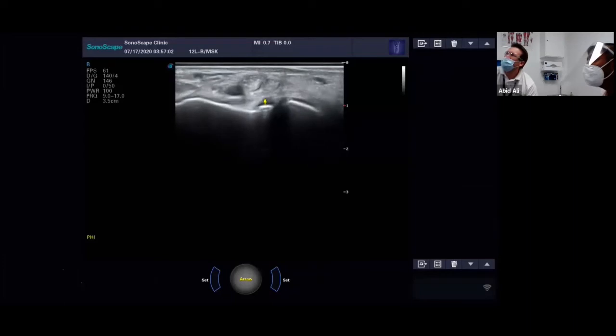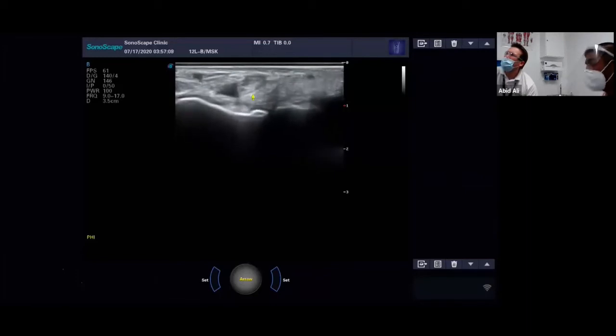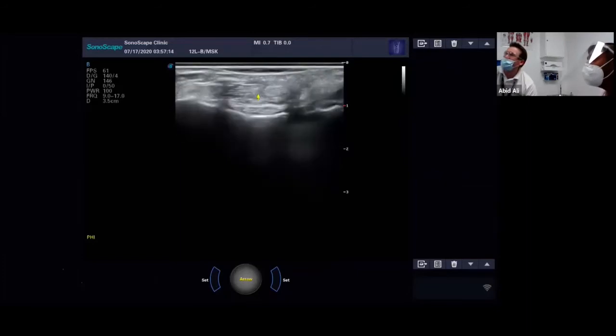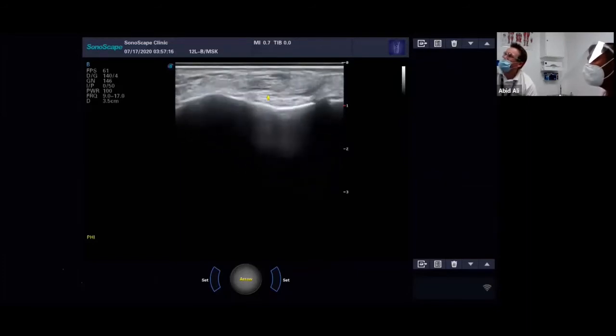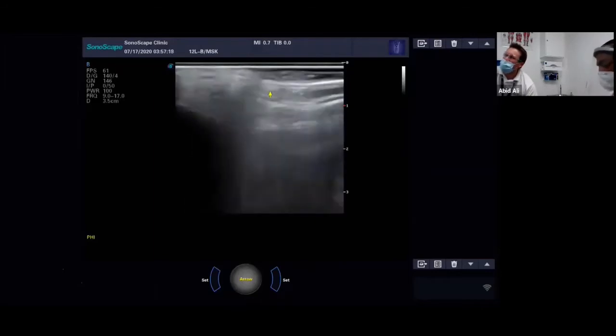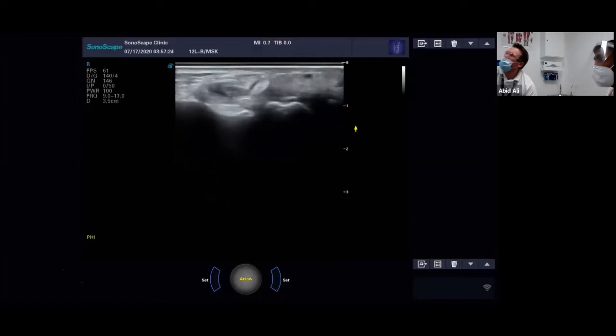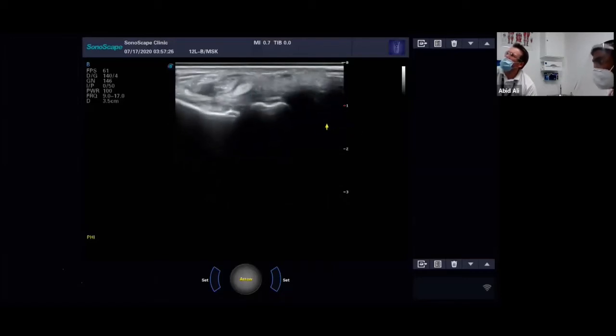So if you watch me try to hold the probe in place with one hand and try to stress his calc, you can just make out some of that movement. Yeah, interesting. That's a whole other kettle of fish doing the peroneals and lateral ankle ligaments, and to get them in good detail takes quite a bit of time and practice and skill. So we'll spend a good hour on that next time because that's very interesting stuff. And a little hammock underneath of the CFL and the peroneal complex.